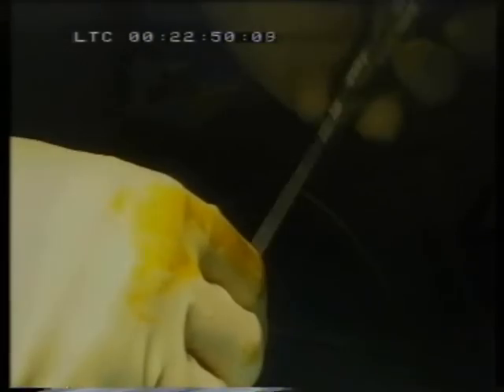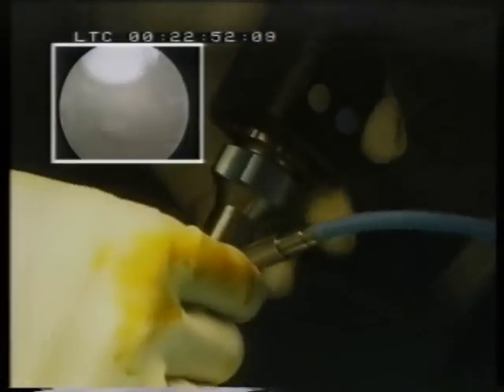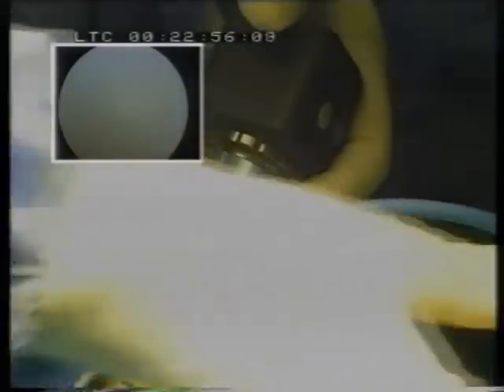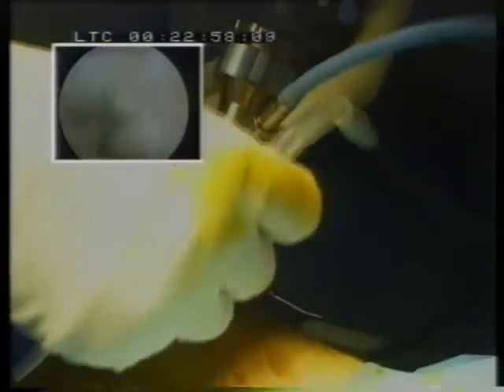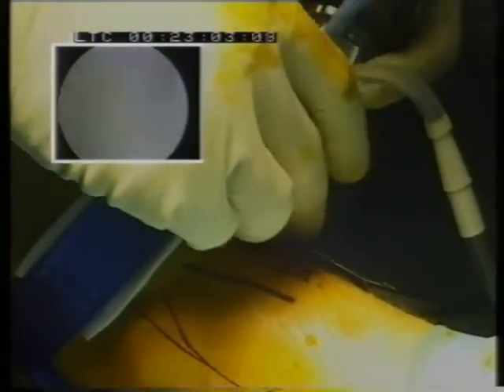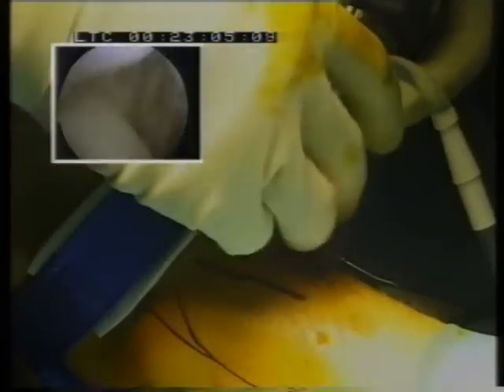You can simply remove the trocar and introduce the 1.9 millimeter telescope. In this instance we're using a 3-chip video arthroscope. Now you go inside the ankle joint.